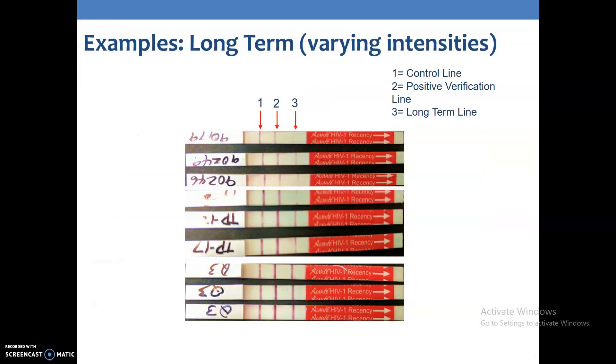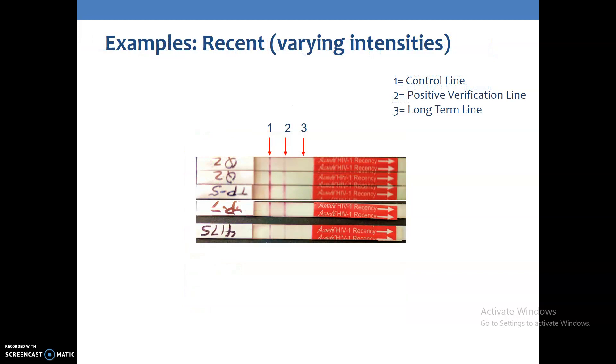These are examples of long-term results with varying intensities. The intensity of the line does not matter — the most important thing is the presence of the line. You can see the varying intensity in the long-term line. These are also examples of recent results with varying intensities. Again, the presence of a line is what matters, not its intensity.